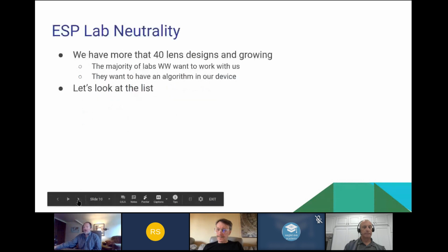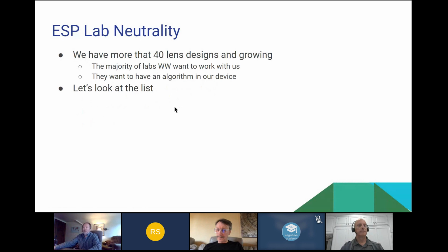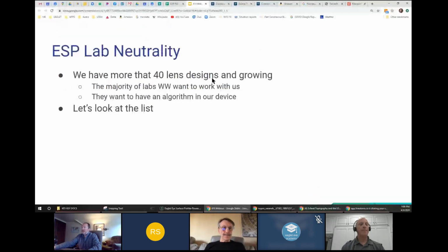And so here we go. We have more than 40 lens designs and growing. The majority of labs worldwide want to work with us, and there's only so much we can do so fast. So we've got to put them on a waiting list and work our way through it. And they want to have algorithms on our device, obviously. So let's take a look at the list.